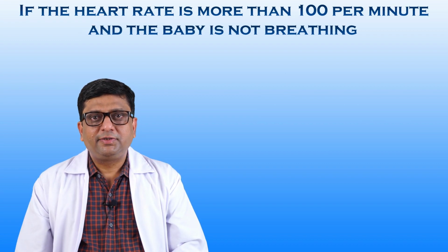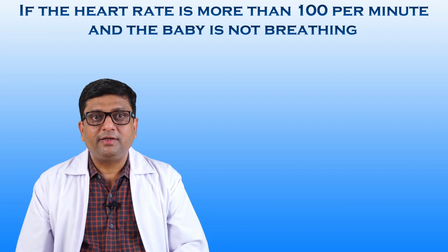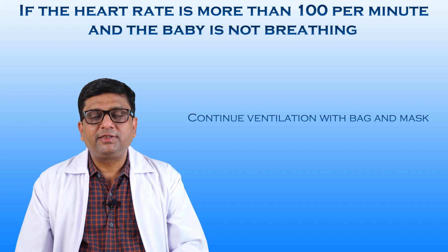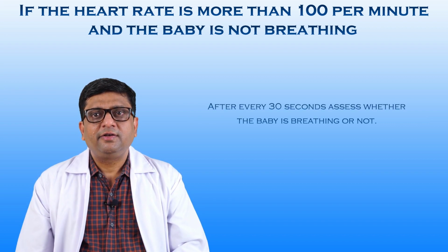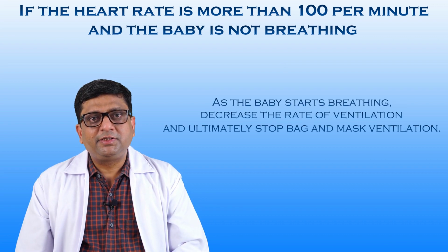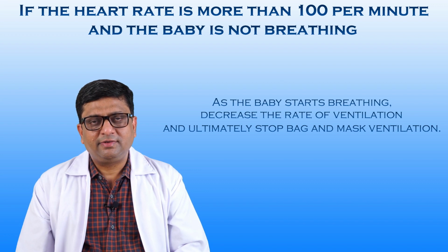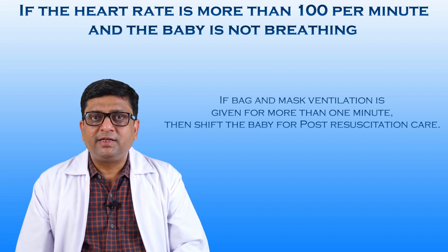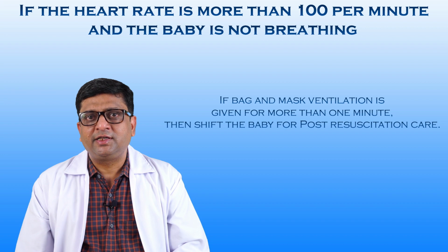If the heart rate is more than 100 per minute and the baby is not breathing, continue ventilation with bag and mask, and after every 30 seconds assess whether the baby is breathing or not. As the baby starts breathing, decrease the rate of ventilation and ultimately stop bag and mask ventilation. If bag and mask ventilation is given for more than 1 minute, then shift the baby for post-resuscitation care.